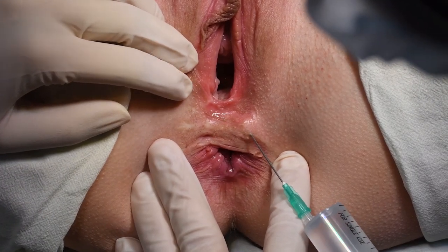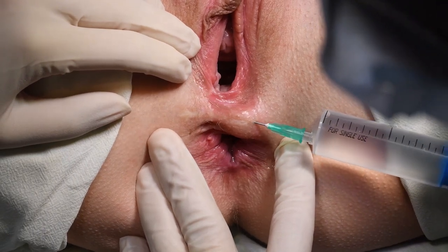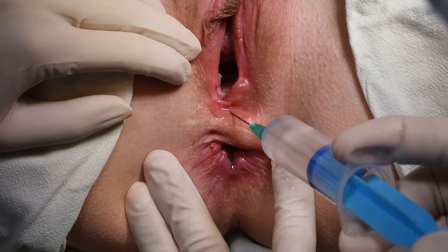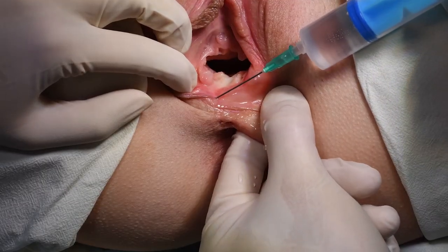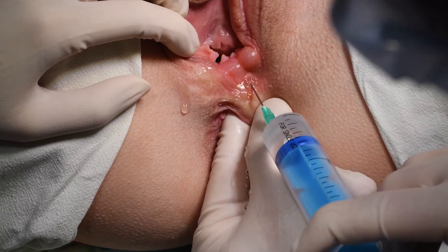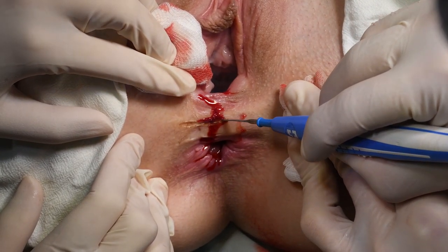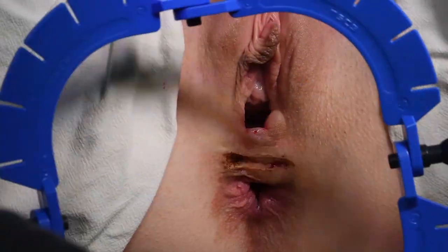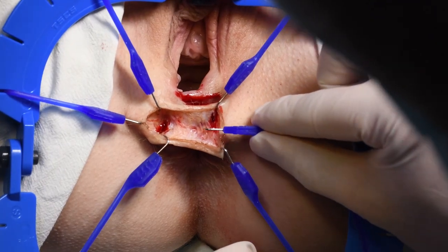After preoperative preparation, an infiltration with local anesthetic and vasoconstrictor is performed to achieve a bloodless operative field. A Lone Star Retractor is placed after skin incision to open the wound.